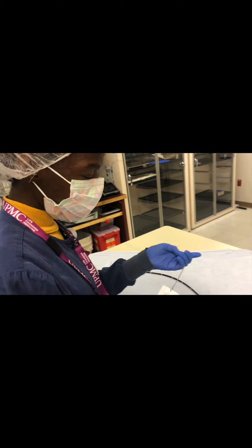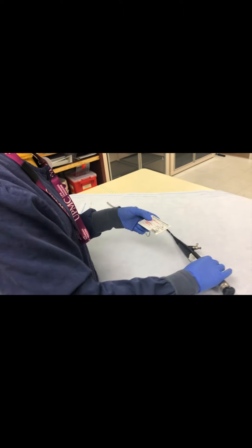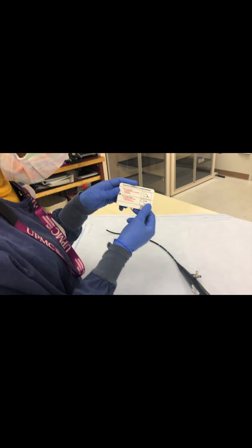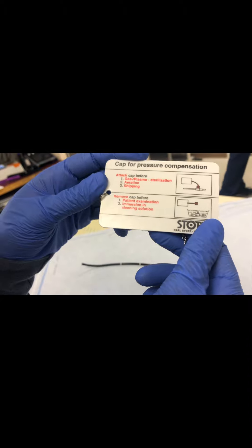So, before we sterilize this cystoscope, we have to put this cap for pressure. It says it's a touch cap for gas, plasma and sterilization, aeration and shipping.